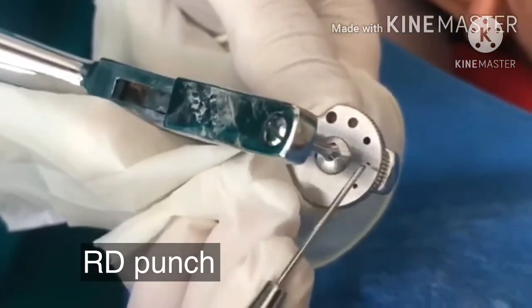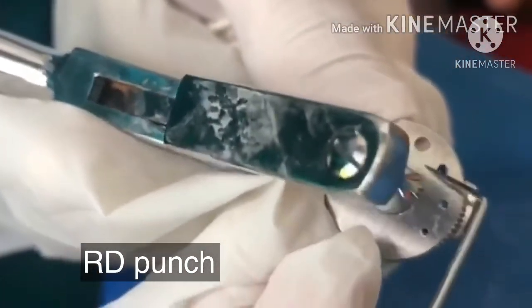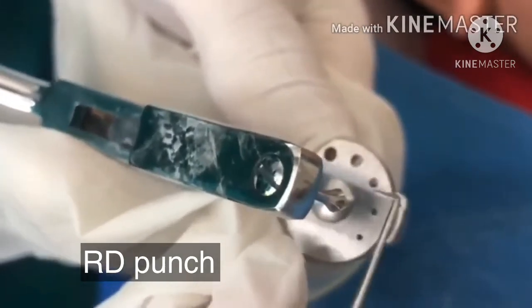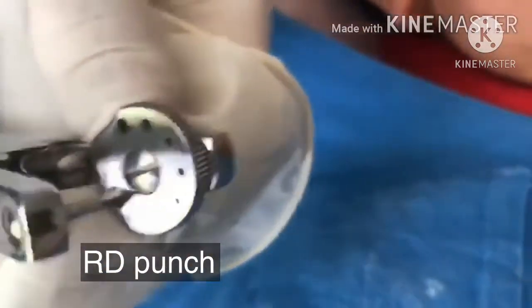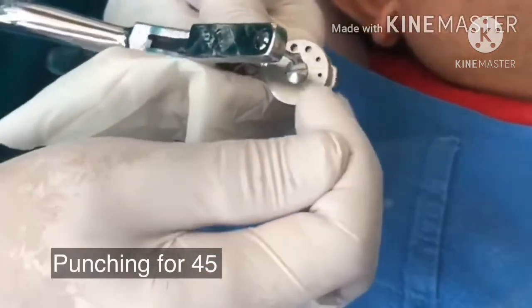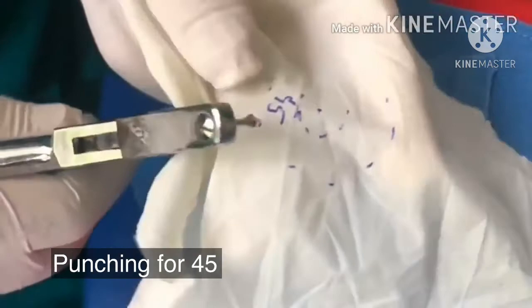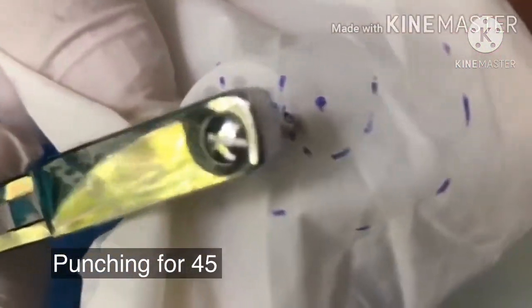Now we see that from the previous punch, if there is some tag of the rubber dam remaining, we just remove it so that the punch that you do is neat. Now we place the second hole in front of the punch. And as I have told you, we have marked on four, five, so we just take it there and we punch.